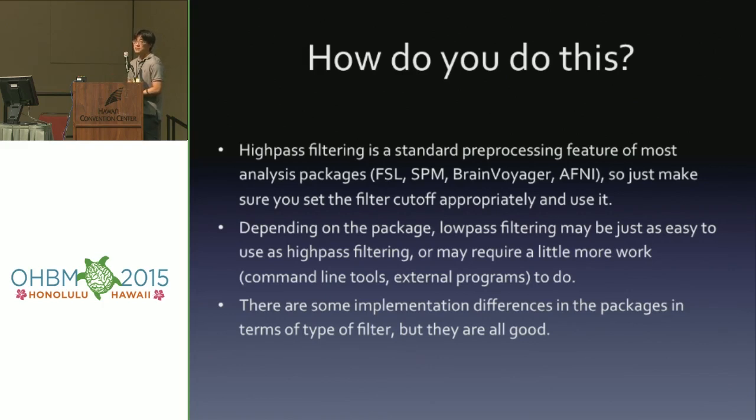There's no button to click. Personally, I use MATLAB because I want a little bit more control of what kind of filter I use. But there are many online tools you can use, and tutorials you can read. All of them give very good suggestions on how to use them.